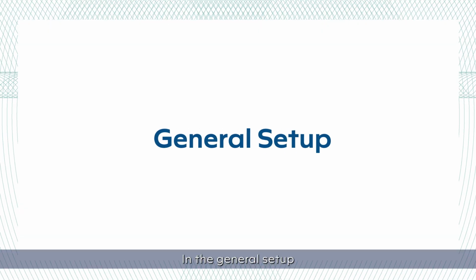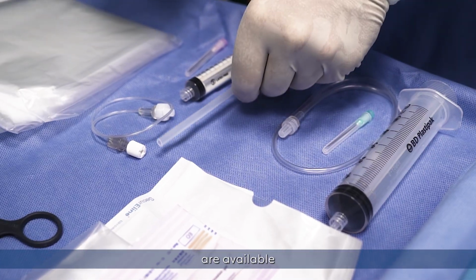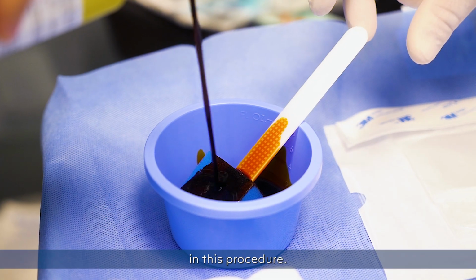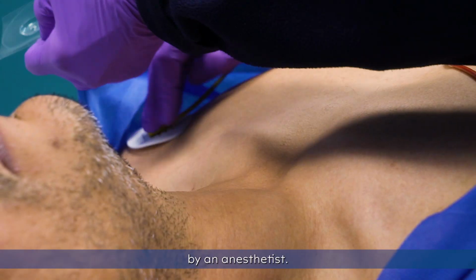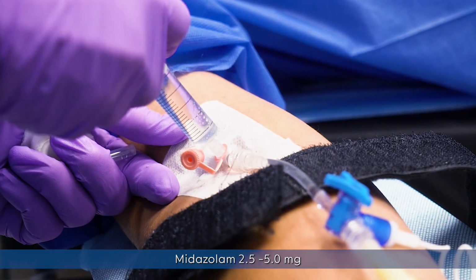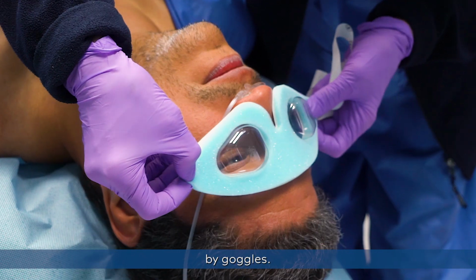In the general setup, a sterile field is prepared. In our operating room, all emergency facilities are available and you can see the various devices and preparations used in this procedure. The procedure is assisted by an anesthetist. Continuous ECG monitoring is performed. Midazolam 2.5 mg is administered. Propofol is infused by a pump, and eyes are protected by goggles.